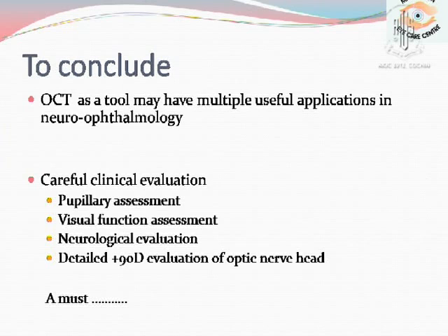So to conclude, OCT as a tool may have multiple useful applications in neuro-ophthalmology, but a careful evaluation in the form of pupillary assessment, visual function assessment, neurological evaluation, and detailed 90-diopter evaluation of the optic nerve head is a must.